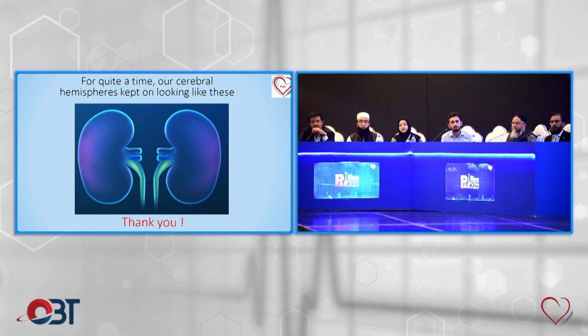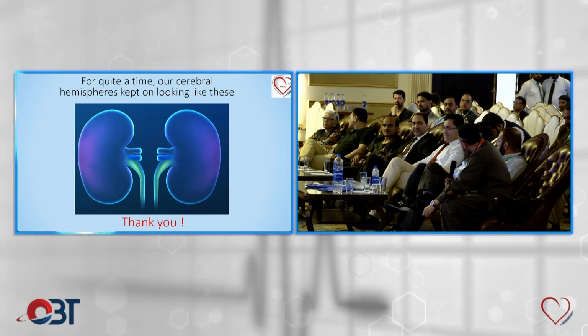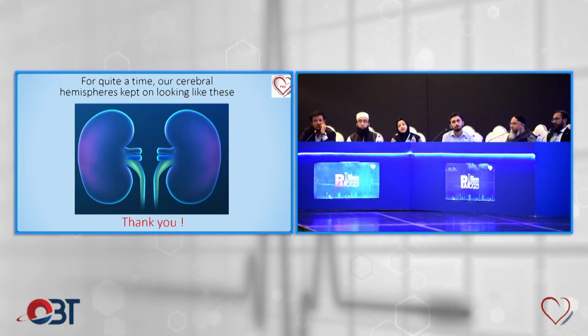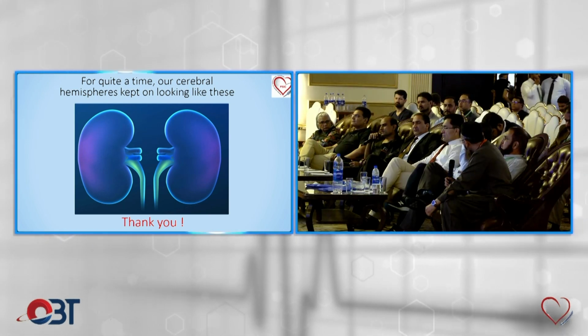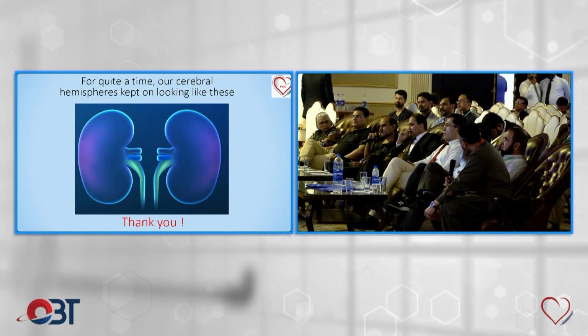I have two questions. Excuse me. What was the size of the guide catheter? Which French did you use, and what was the frame rate during the PCI procedure? Sorry. It was a 7 French, and it was a routine frame rate. The fluoro is 10 and the cine is also at 10.